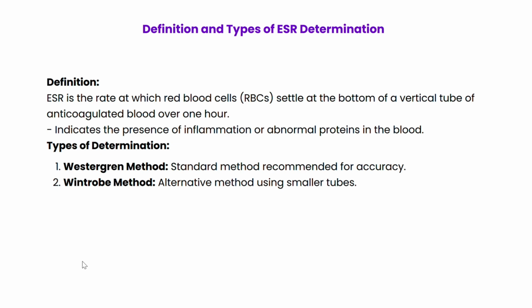Now, what exactly is ESR? ESR or erythrocyte sedimentation rate measures how quickly red blood cells settle at the bottom of a test tube in 1 hour. When there is inflammation or abnormal proteins in the blood, the RBCs settle faster, increasing the ESR value.